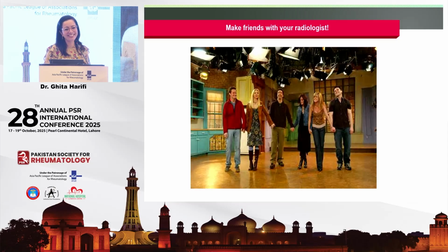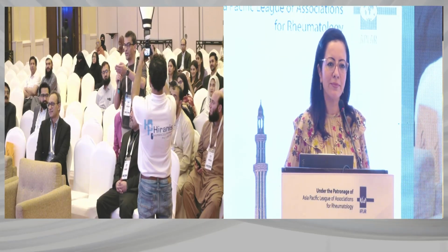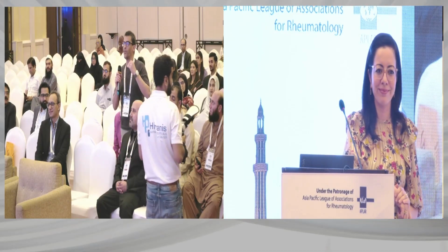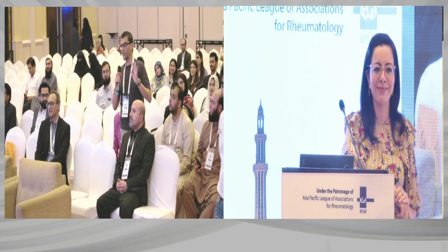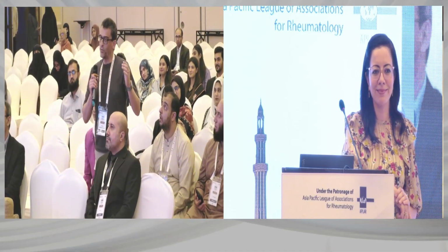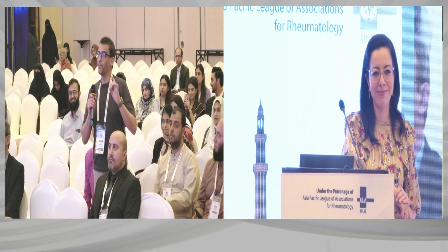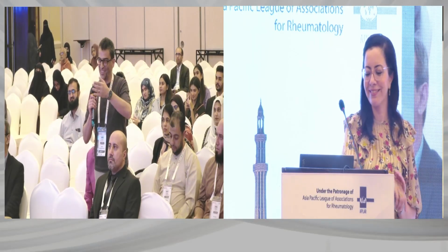Thank you. A question that is not a question, maybe a comment. You said that maybe we need to upgrade or modify the criteria that we have now. I totally agree. Bone edema alone is sometimes over-diagnosed, and it's highly sensitive, but yes, I agree with you, it's not specific. But in another way, if we wait until we see the bone erosion, which is specific for sacroiliitis, for me that is late as a rheumatologist. We need to prevent this. Don't wait until we see the bone erosion.